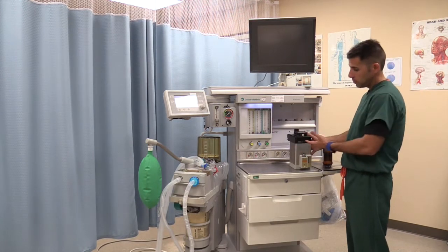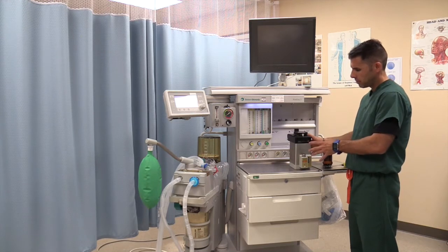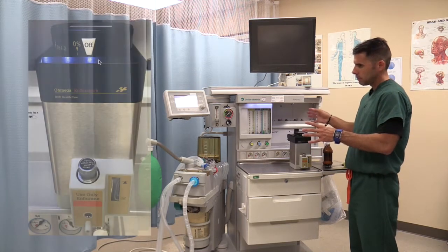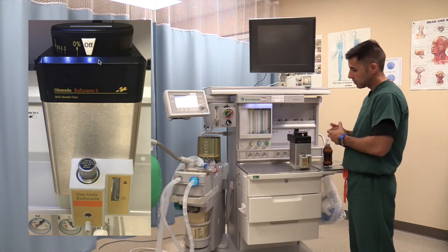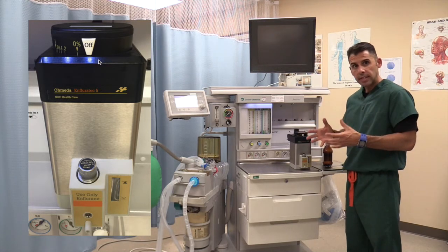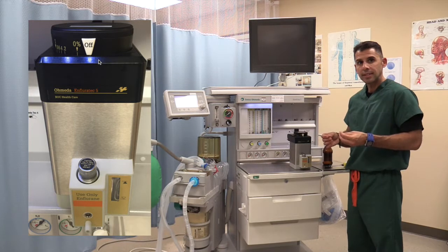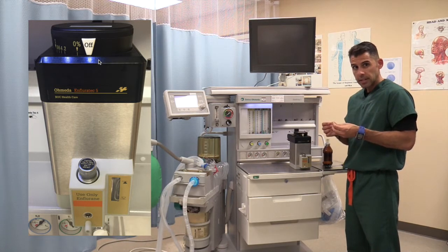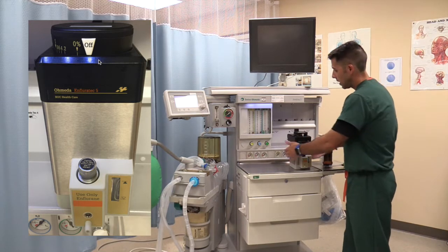For demonstration purposes, I have removed the vaporizer. The vaporizer was part of Boyle's Apparatus — now called the anesthesia workstation. The purpose of the vaporizer is to take the anesthetic liquid and turn it into a vapor so that we can deliver our anesthetic.